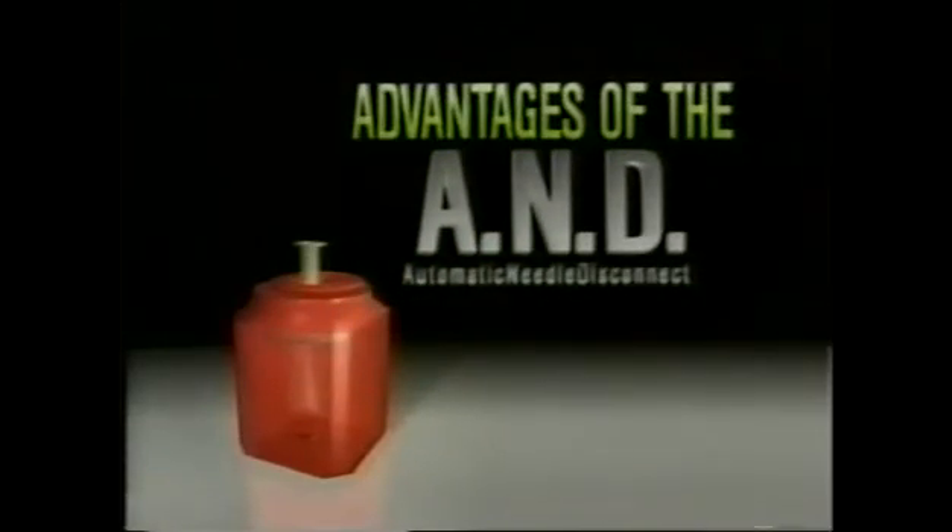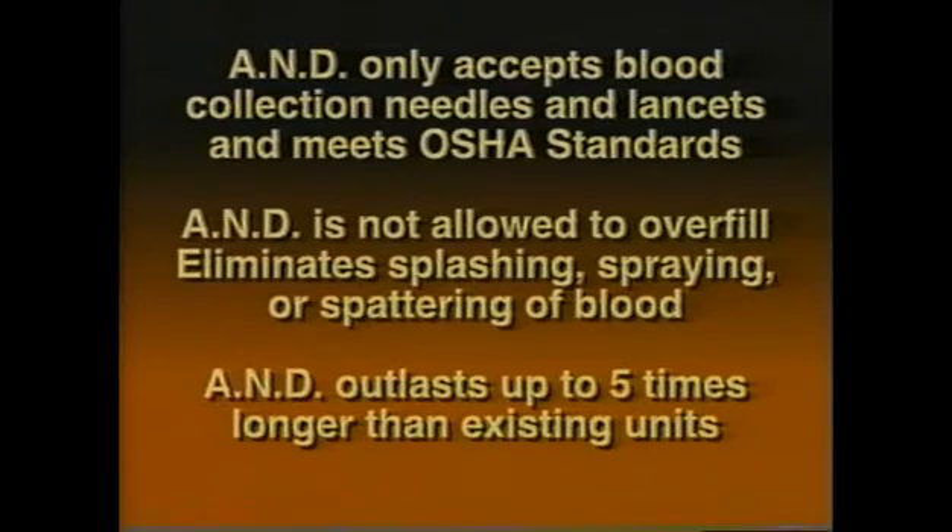The Post Automatic Needle Disconnect System offers several critical advantages. The AND only accepts blood collection needles and most lancets and meets all of OSHA's standards. The container is not allowed to overfill. Used correctly, the AND eliminates splashing, spraying, or spattering of blood with no change in blood drawing techniques. And with a service life of up to five times as long as its competitors, the Post AND System substantially reduces disposal costs.